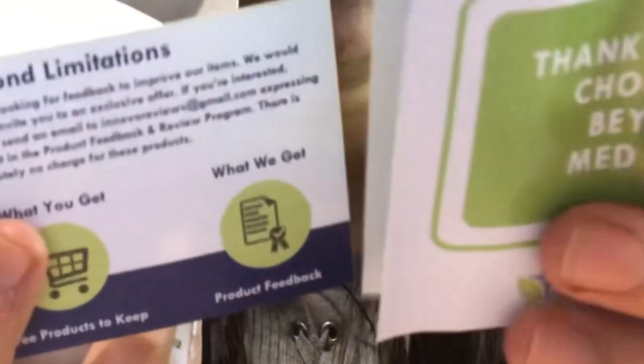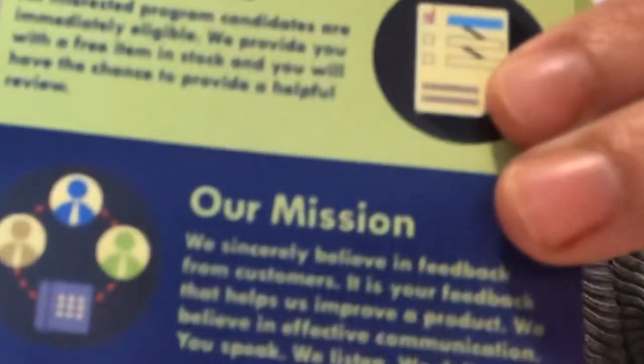I will link all the products down below if you want to buy it. I think they have so many colors — when I checked it on Amazon, it has pink, red, blue, black, and violet. They also include an instruction booklet in here. This is really an unboxing — the first time I've opened it.